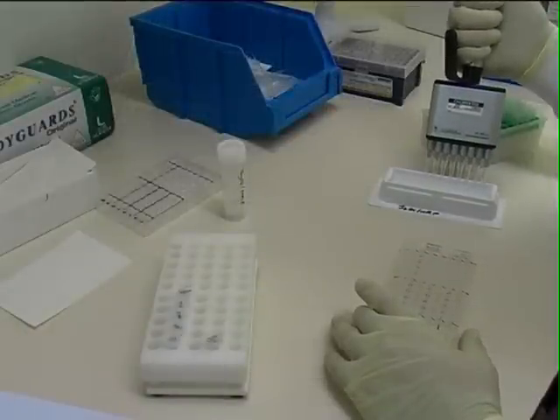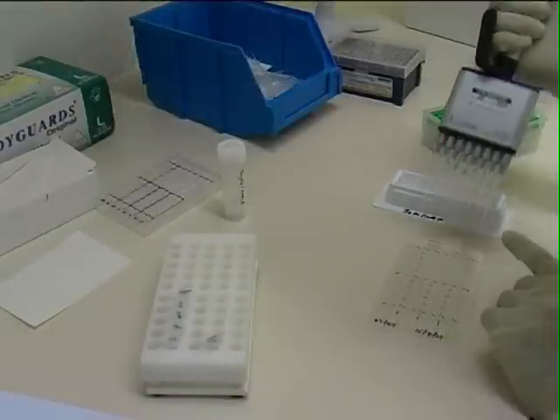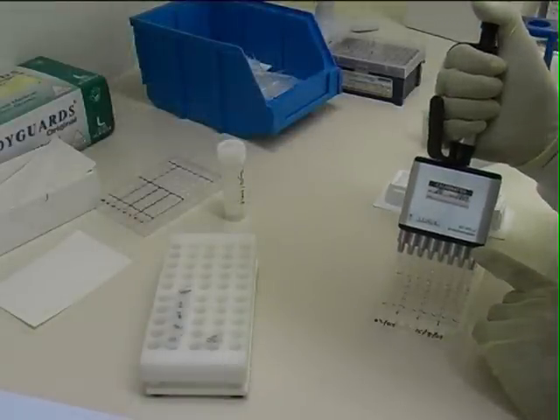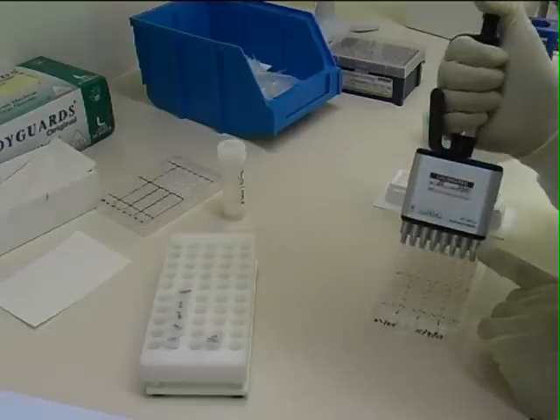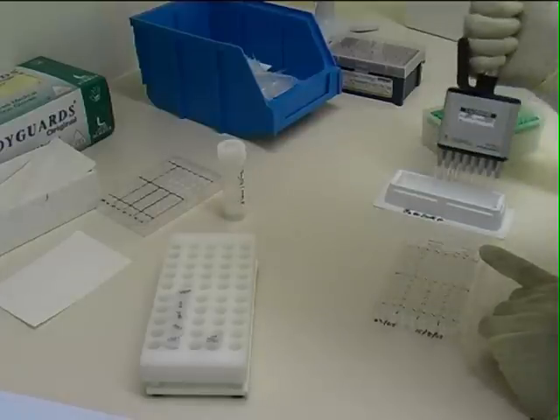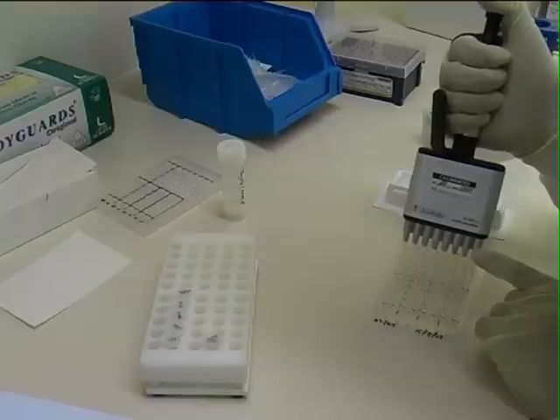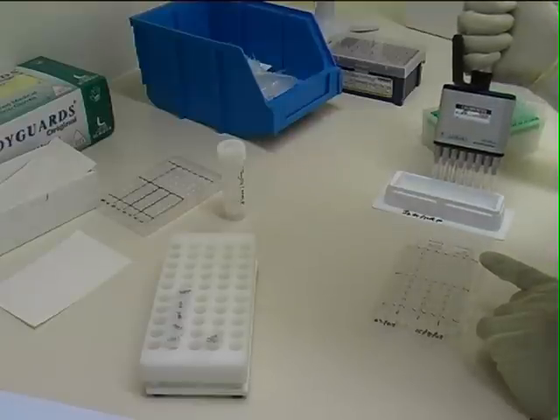After half an hour, any unbound material is discarded and the plate is washed six times as before. Then peroxidase labelled anti-human IgG is added to each well. The plate is sealed and incubated at room temperature for an hour.